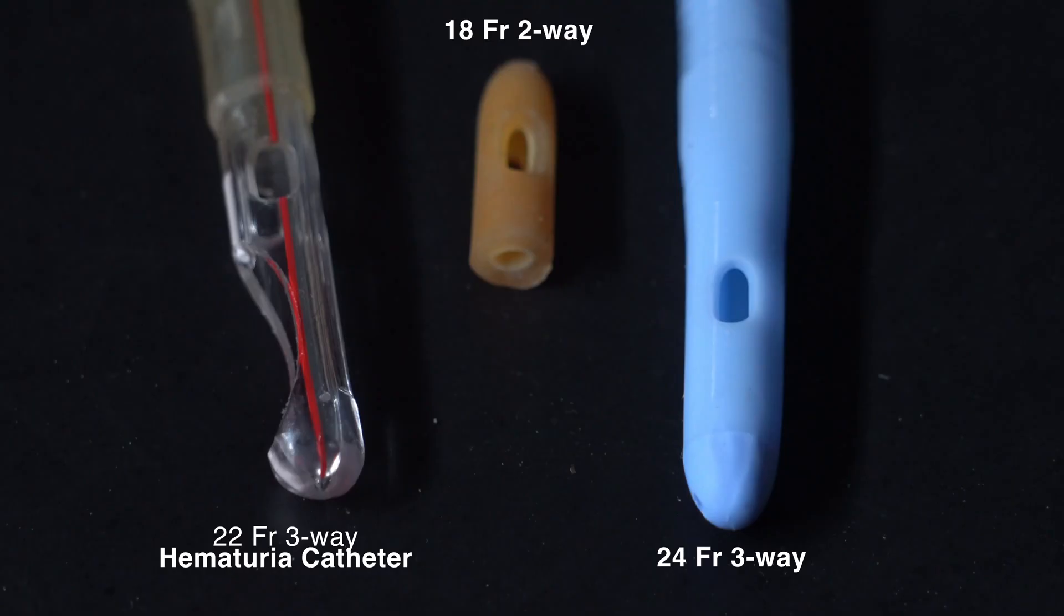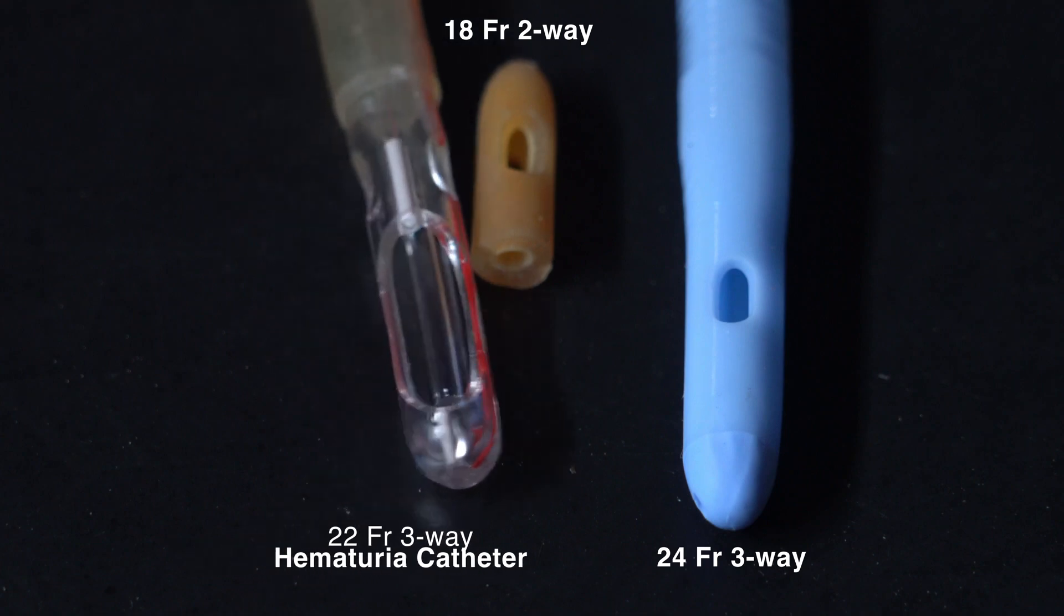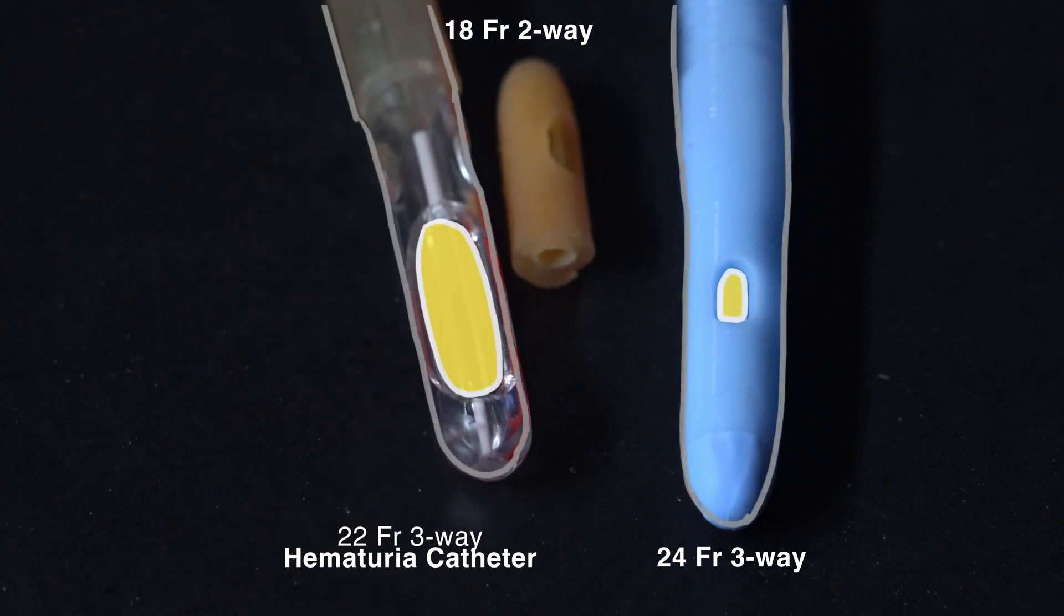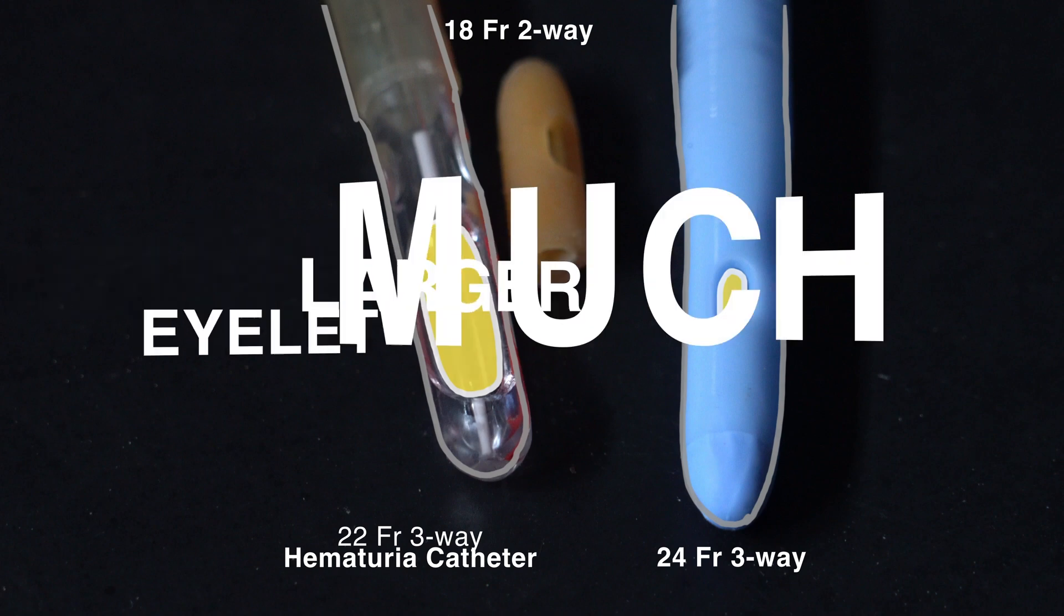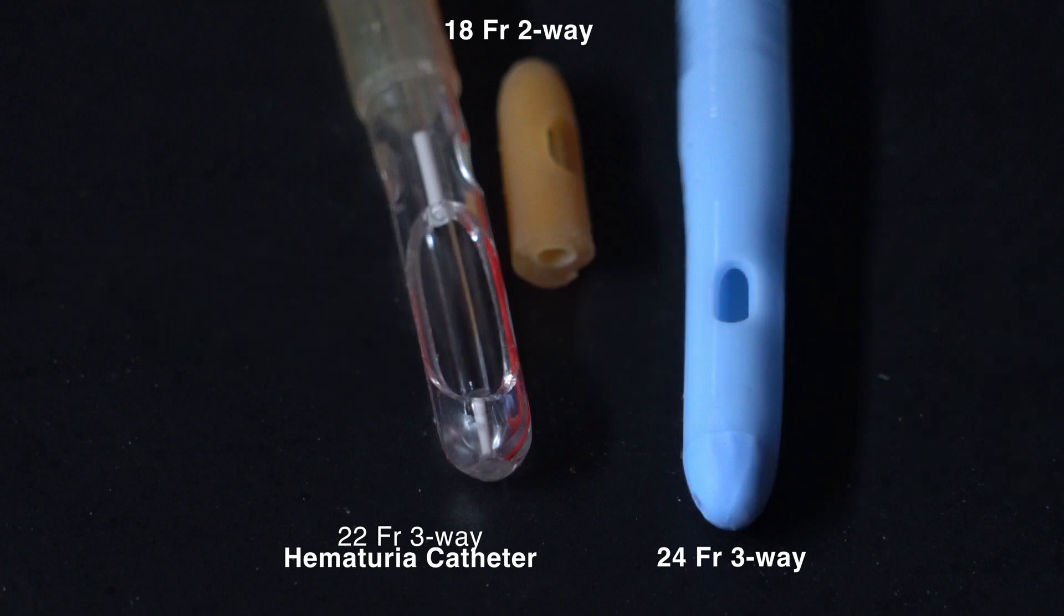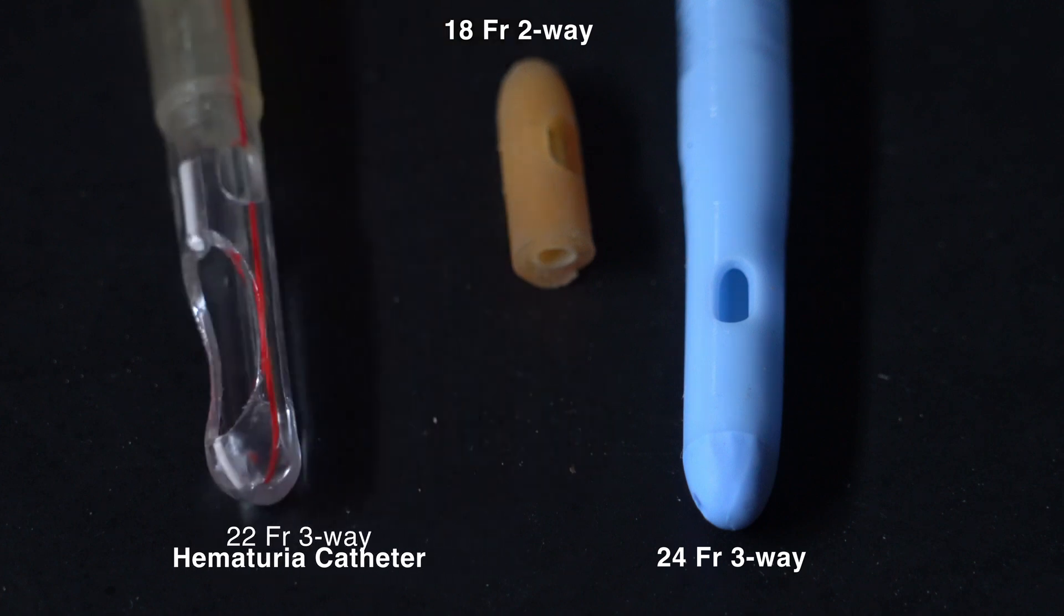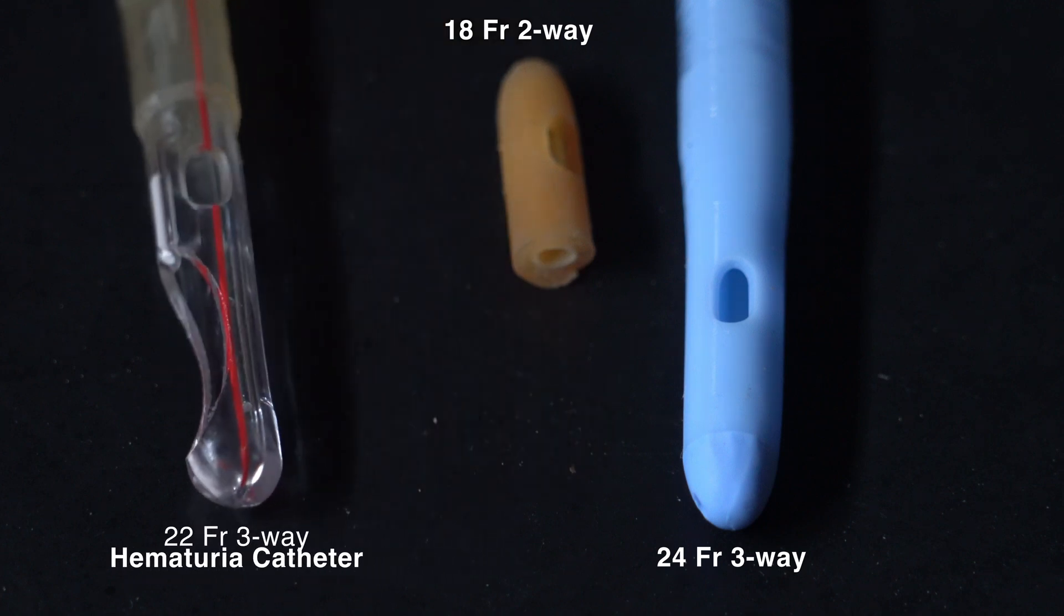Generally, these catheters also have a larger opening at the tip of the catheter to allow removal of larger blood clots. Just because the catheter is larger does not mean it's designed as a hematuria catheter. On the left, here we have a 22 French three-way hematuria catheter. Notice the very large eyelet size, which is ideal to remove large clots. In the middle is an 18 French Foley catheter for comparison and on the right is a 24 French three-way Foley catheter. This one is not a hematuria designation and notice the smaller eyelets, which would make moving clots much more difficult.